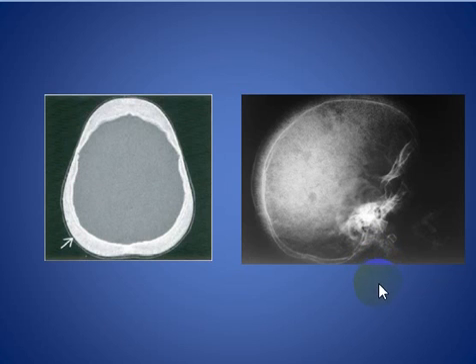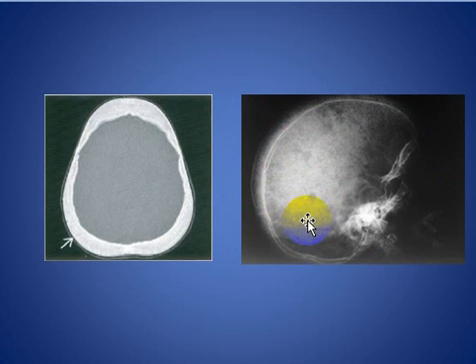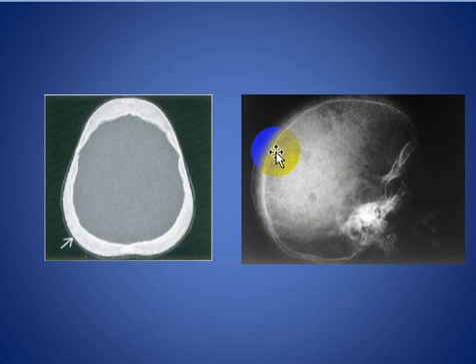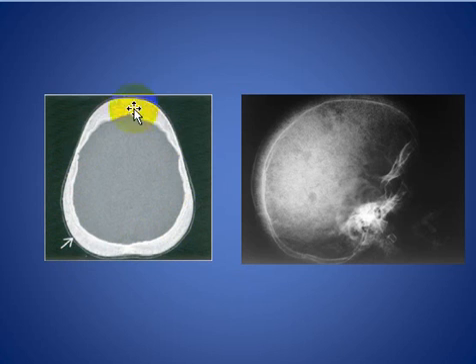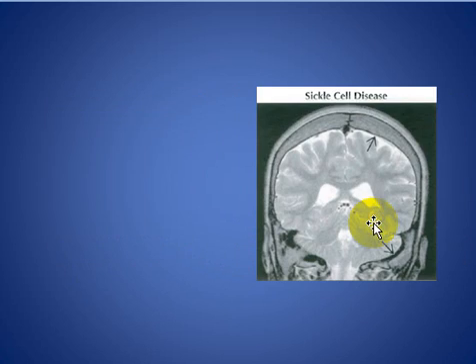This patient has chronic anemia — thalassemia — and on the lateral skull X-ray you can see the classic hair-on-end appearance with diffuse thickening of the diploic spaces due to bone marrow hyperplasia. Here is another patient with sickle cell anemia showing diffuse diploic space thickening and widening, also involving the base of the skull.